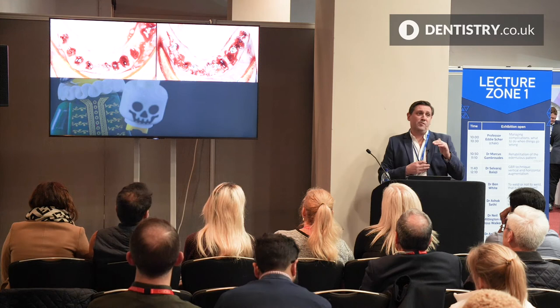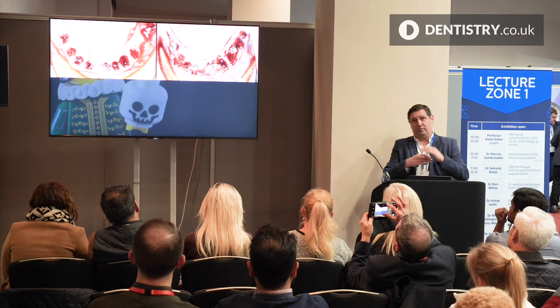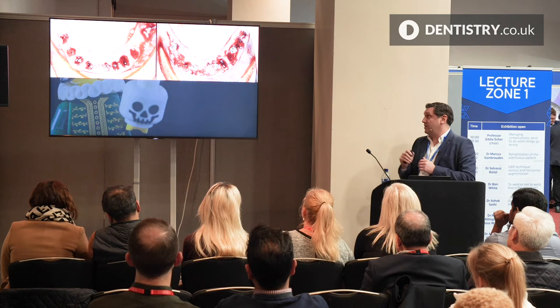in to convert it to a tissue level, and you get a bit of soft tissue healing and you can see the abutment, you can change that and you can put a shorter one in or a longer one in if you need to. After a couple of years, you're seeing really lovely healing. I'm confident that the tissue is going to be stable, and so I tend to, certainly on the lower, use more tissue level. So you've got no connection there at all.